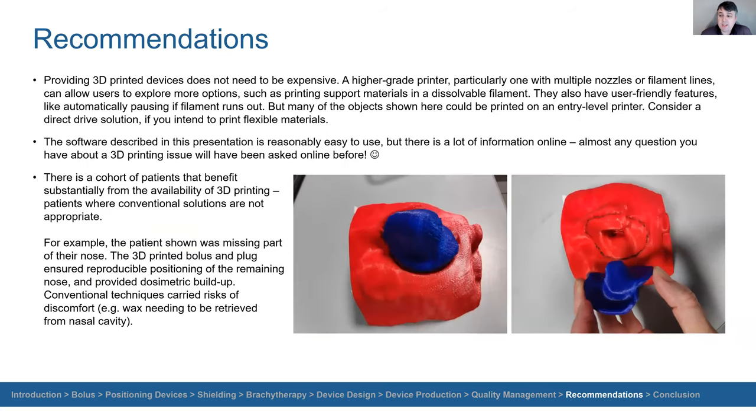So a couple of recommendations, almost at the end. Providing 3D printed devices does not need to be expensive. Some of our printers are higher grade, they have multiple nozzles and they've got some ease of use features, like if it runs out of filament, it will automatically pause and you won't have wasted that time.